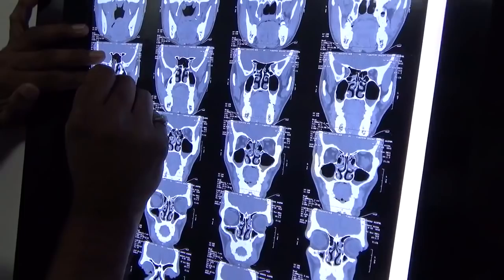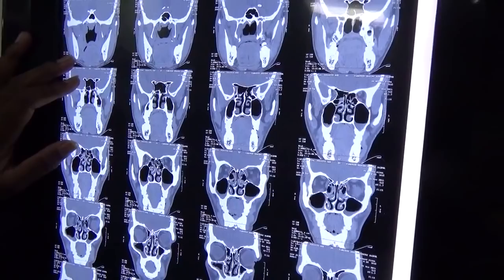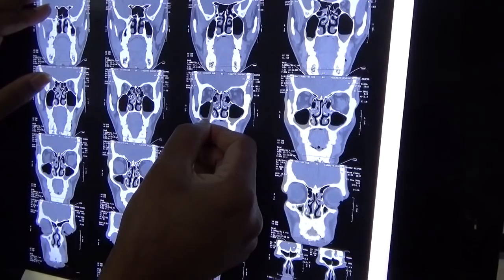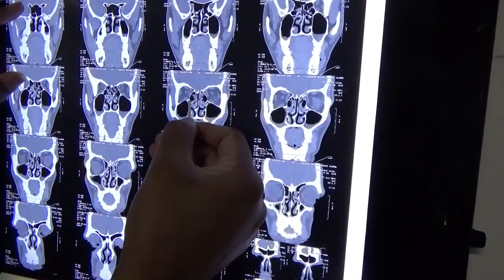So intraoperatively, how to identify this Onodi situation? This is preoperative assessment. Preoperatively, you must assess Onodi situation in every CT scan. Intraoperatively, first you define the maxillary line — that means the superior border of the middle meatus. If you extrapolate that, the maxillary line leads to your sphenoid sinus, sphenoid ostium.